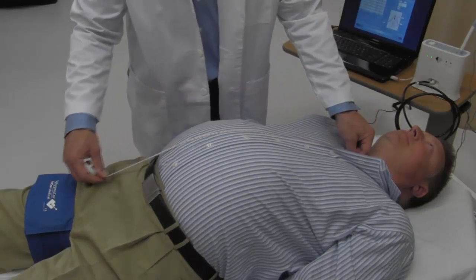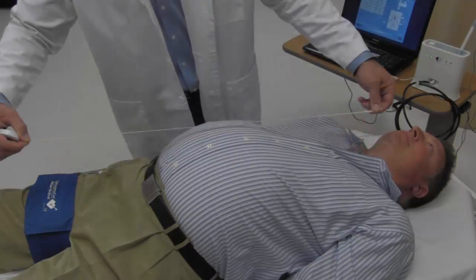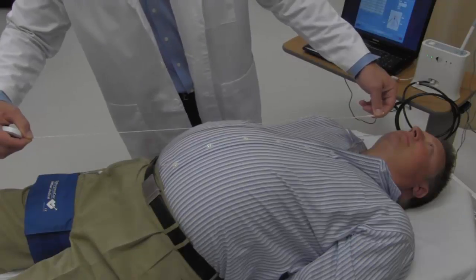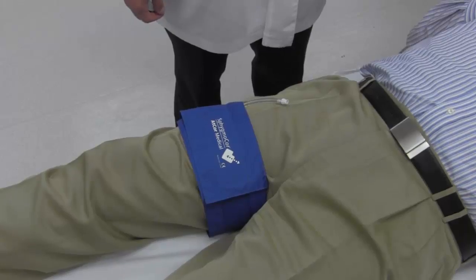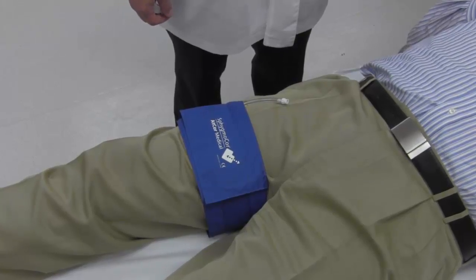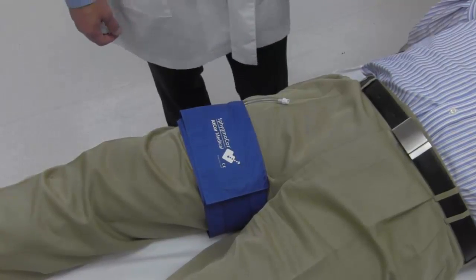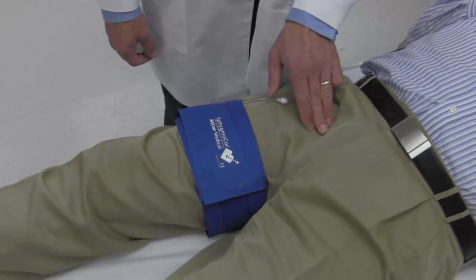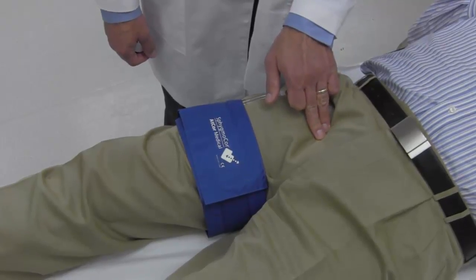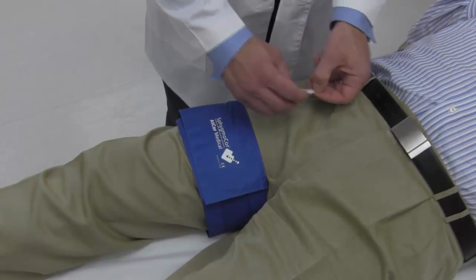For a more accurate distance measurement, lift the tape measure off the subject's body, keeping it in a straight line, parallel to the surface the patient is laying on, and carefully measure in this manner. Finally, measure the distance in a straight line from the palpated location of the patient's femoral pulse to the top of the thigh cuff. The femoral pulse is best felt at an angle approximately 45 degrees inward from the hip bone by the groin or crease of the leg.